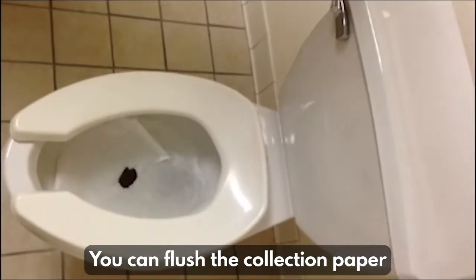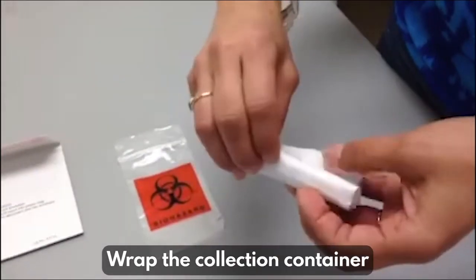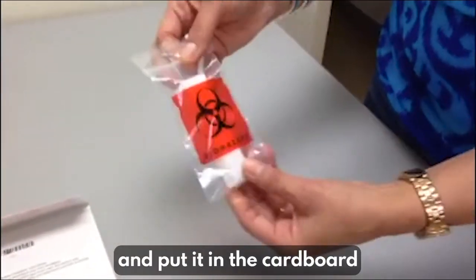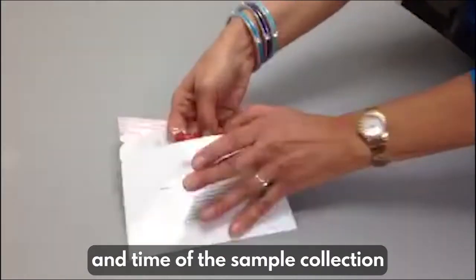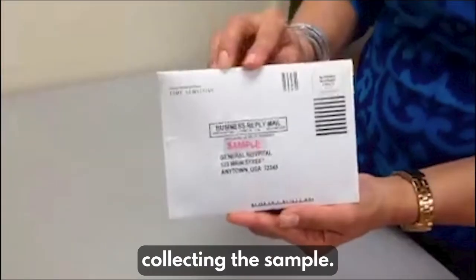You can flush the collection paper after. It is biodegradable so it will not clog your toilet. Wrap the collection container in the absorbent pad and put it in the biohazard bag. Seal the biohazard bag and put it in the cardboard return envelope. Write the date and time of the sample collection on the envelope. Seal the return envelope and bring it to the laboratory within seven days of collecting the sample.